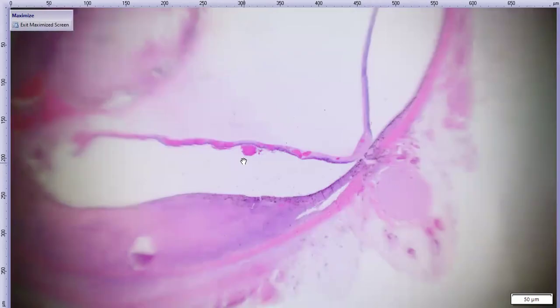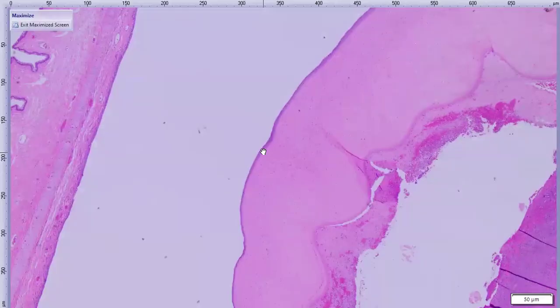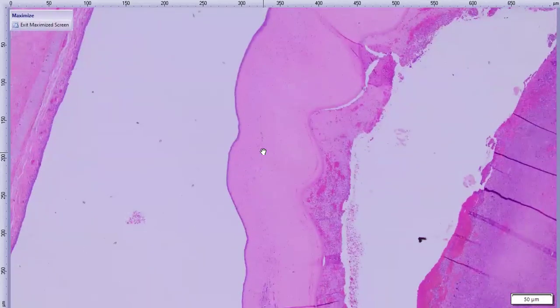The retina is detached. One of the reasons we can tell that's real, from this magnification at least, is this blob of hemorrhage here. So whenever you have something convincing in the subretinal space, it's good evidence that it's true retinal detachment. Okay, so let's go ahead and jump to higher mag here. So here's our cornea. Oh, I lied. It's not ulcerated. The epithelium is still present here.